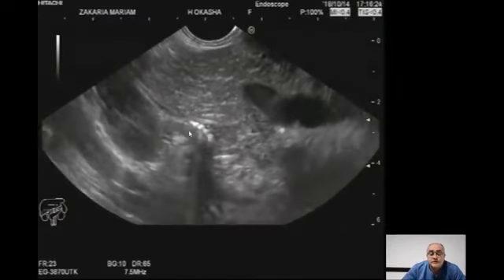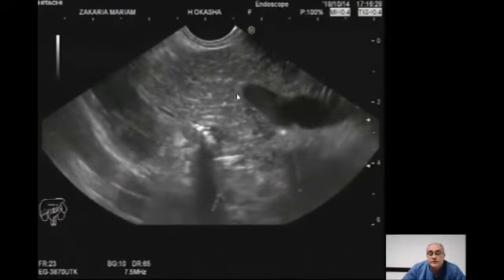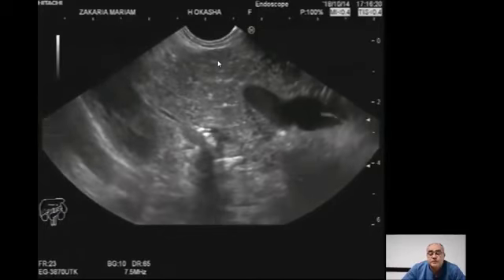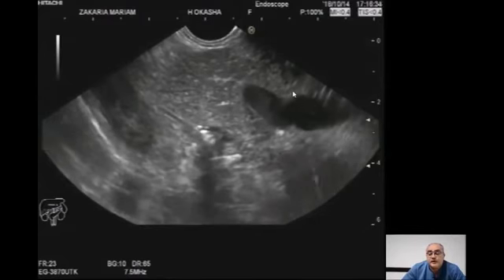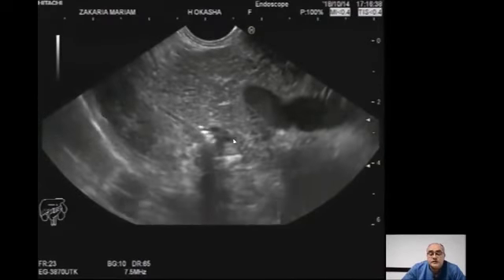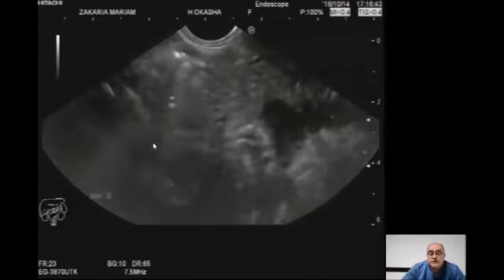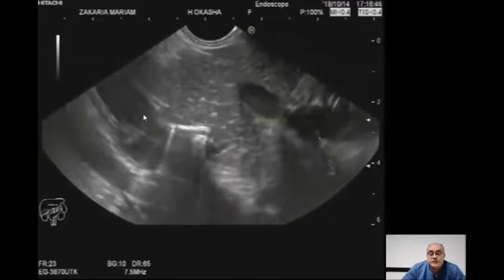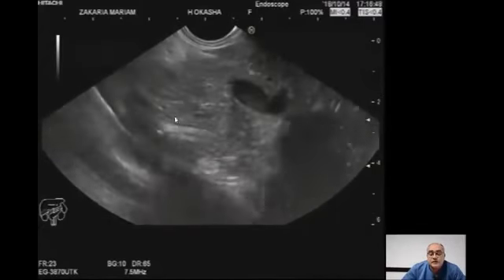Yes, here this is a large papillary mass, and the distal CBD and the portal vein and the superior mesenteric vein and a large part of the head of the pancreas above and below the superior mesenteric vein, and the neck of the pancreas at the confluence. And here this is the common bile duct going to the papilla, and this is the pancreatic duct here.